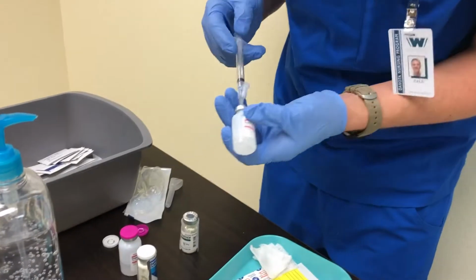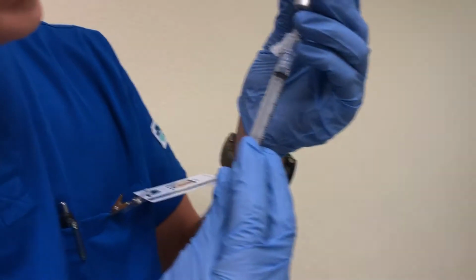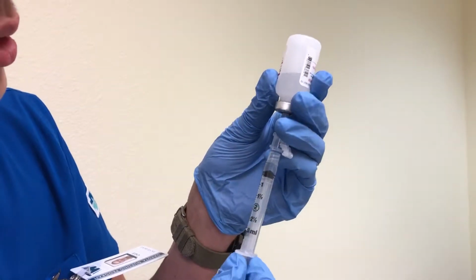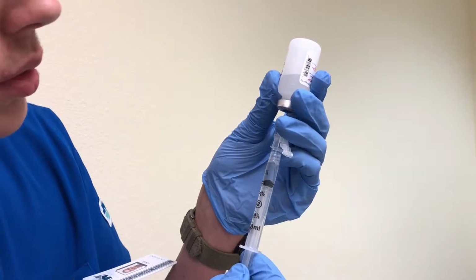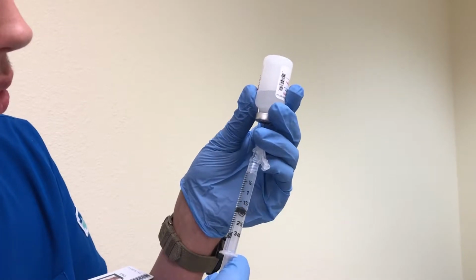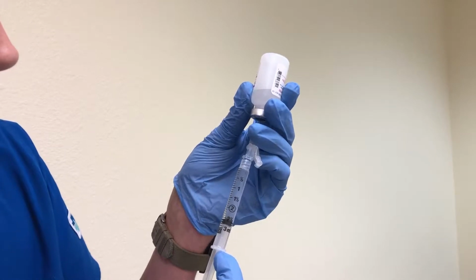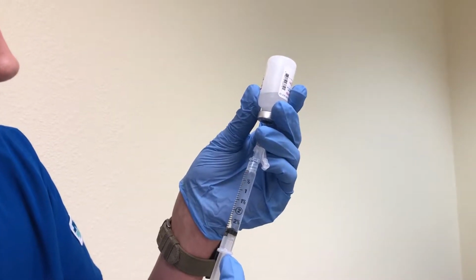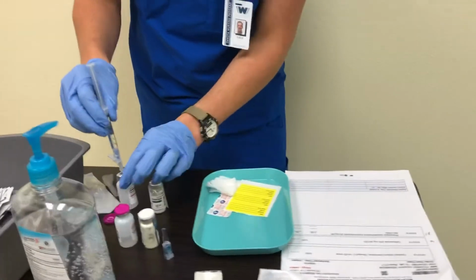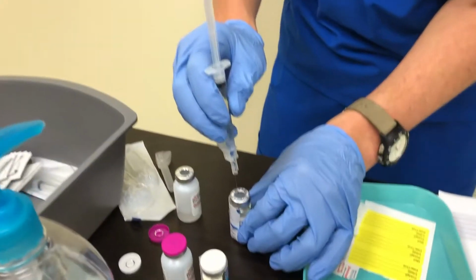And then I'll invert and make sure my needle is completely submerged, and I can then start pulling liquid. There I'm at 3 mils, so then I can invert, pull my needle out, and then I can go in and put this in.